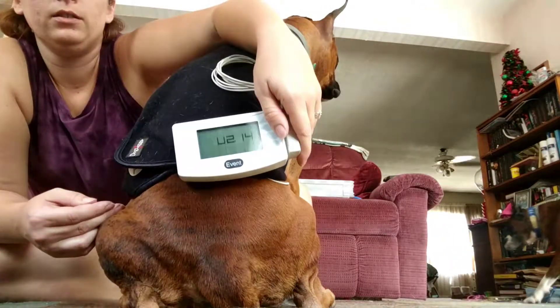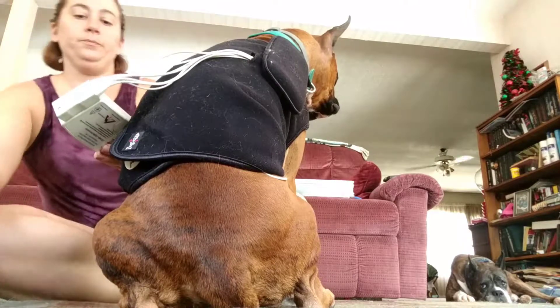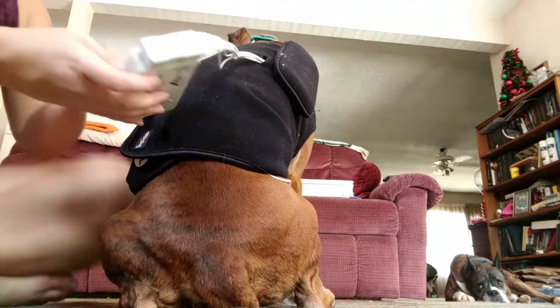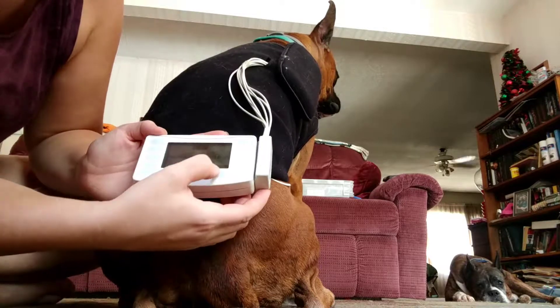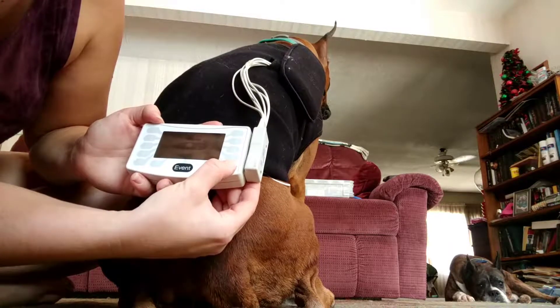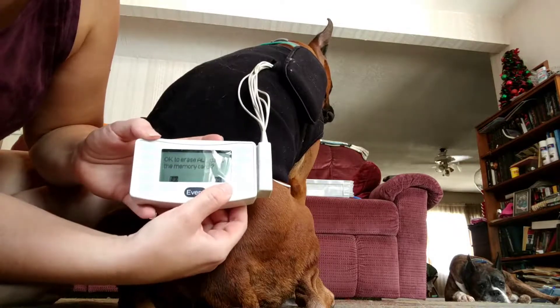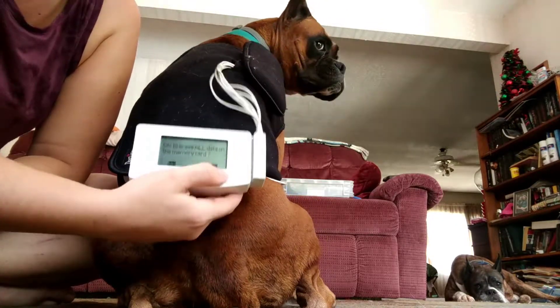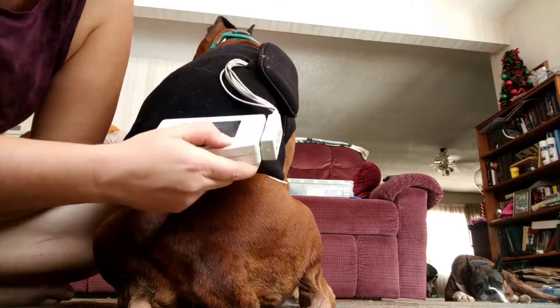It's just going to take a minute to come on. It says 'recording over one hour old' because this has been used before, so we want to hit Erase — it's the bottom one. If this was a monitor you previously used and didn't download, doing this will lose it forever, so don't erase if you're unsure. Download it first, then come back and erase. I'm going to go ahead and erase it.